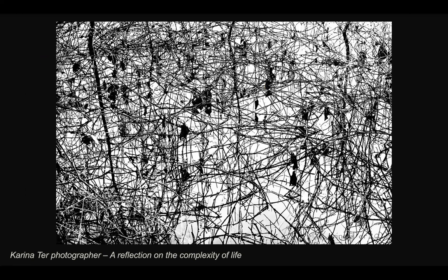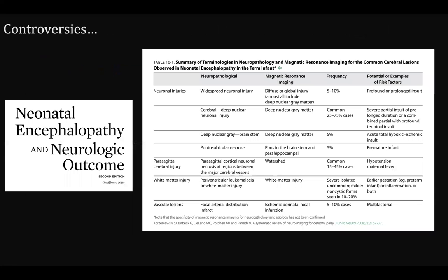This is already complex enough, but actually, if we check the literature written by the neonatologists, from which we can learn a lot, to be fair, we see that there is a lot of controversy or a lot of overlap in the clinical radiological findings.